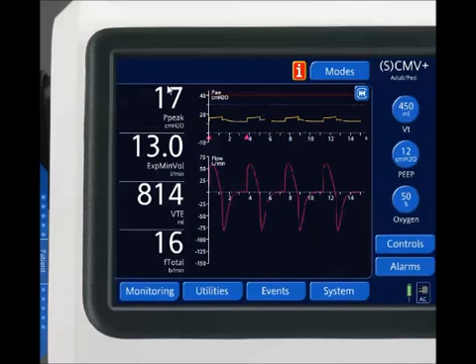And with this ventilator, how far my peak pressure titrates down is limited. It's based on my PEEP setting here. So it's only going to drop my peak inspiratory pressure to 5 above my PEEP. If my PEEP is set at 12, that limits how low it goes. So 5 on top of 12 is 17. That's why it's not decreasing anymore.